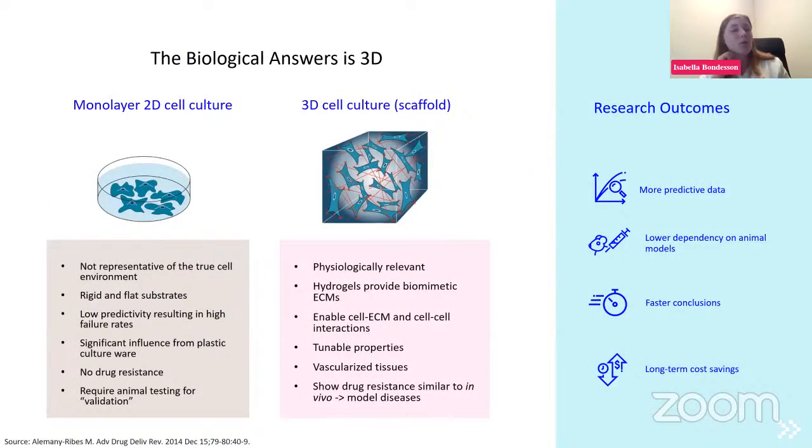But before that, I won't dwell too much on this slide, as we have talked a lot about the benefits of using 3D bioprinting. However, I think it's a really good slide to show why 3D cell culturing holds the answer to solve a lot of the obstacles we are currently facing within drug discovery, as the cells get to interact in a more in vivo-like environment.